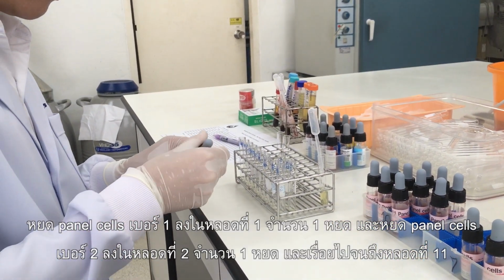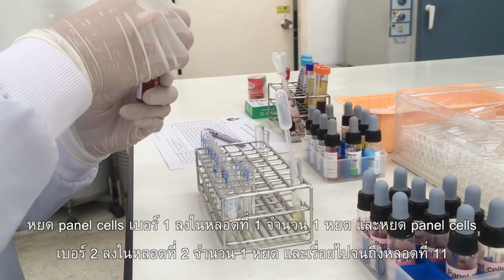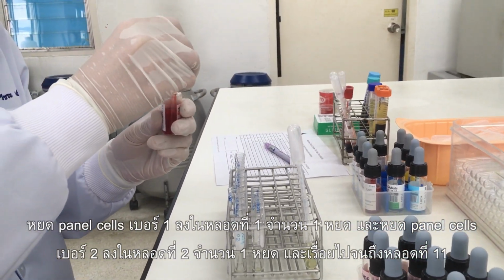Transfer 1 drop of the particular panel cells into each tube corresponding to the identified number.